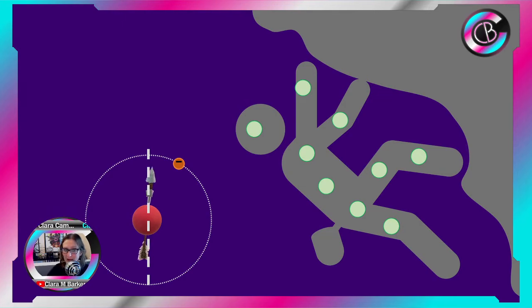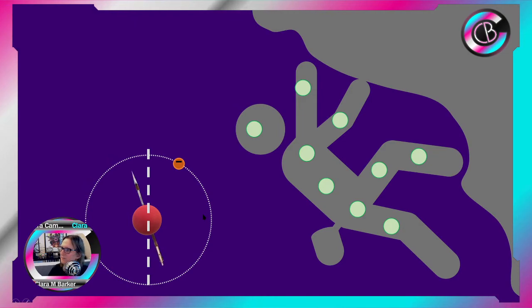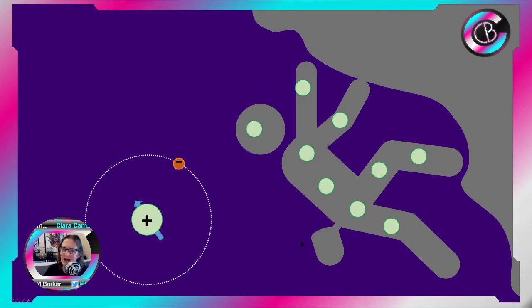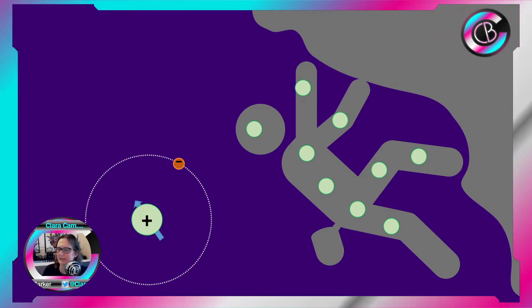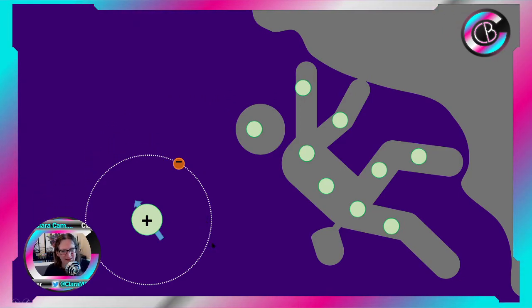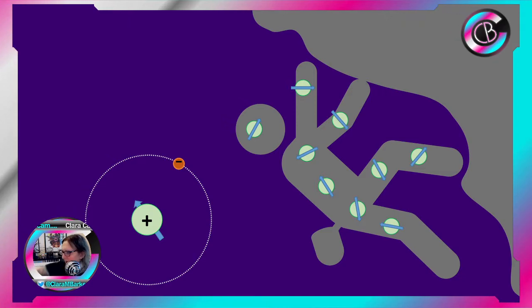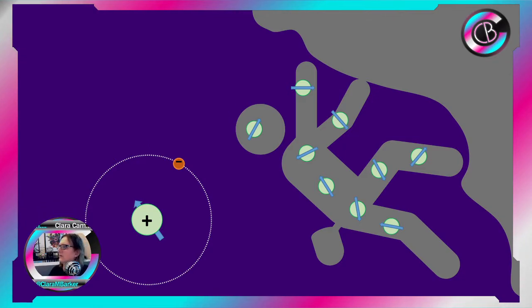I'm not going to get into why, but this is something that's happening. So it's spinning on its axis. We can just say we've got this hydrogen atom, and then we've got this direction of the spin. And in a magnetic material, all these spins line up and you've got a magnetic field. So why aren't humans magnetic? Well, maybe I have a magnetic personality, but maybe I don't. And that is because all the hydrogen spins are random. They're all pointing in different directions, so they're all cancelling each other out, right?